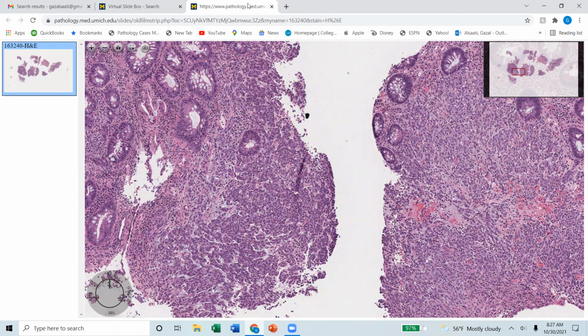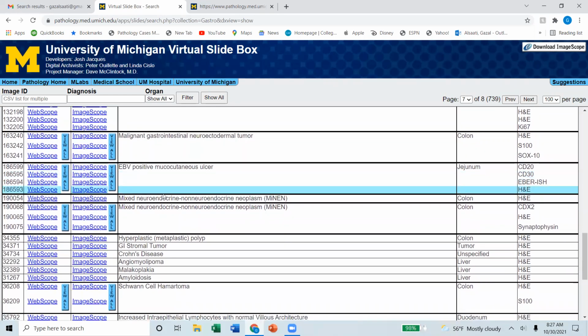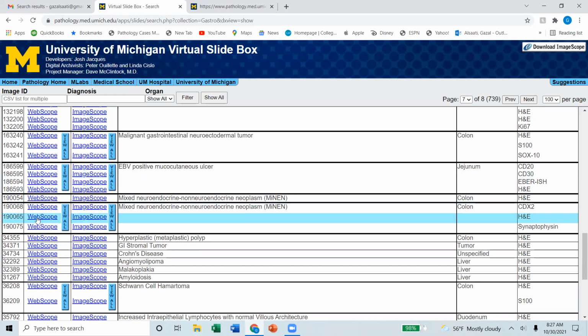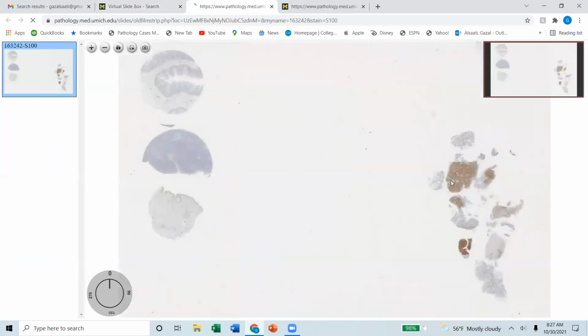So this tumor is very challenging to diagnose, but the giveaway is the age. Patients are very young, less than 20 years old. It doesn't happen pretty much in older ones. Let's see, what do they have here? They have SOX10 and S100. Oh, nice. These both are going to be positive.